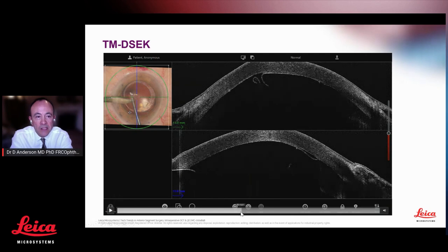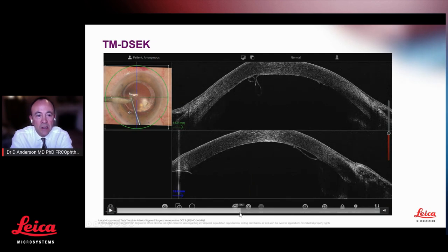And that is something that we can see clinically because we have a nice clear red reflex, which is centered on the operating microscope and on the screen up to your left, but also particularly when we're performing these surgeries in eyes that have had a penetrating keratoplasty or in eyes which have had other pathologies such as posterior membrane dystrophies. We really want to see Descemet as opposed, for example, to stromal tears or folds.